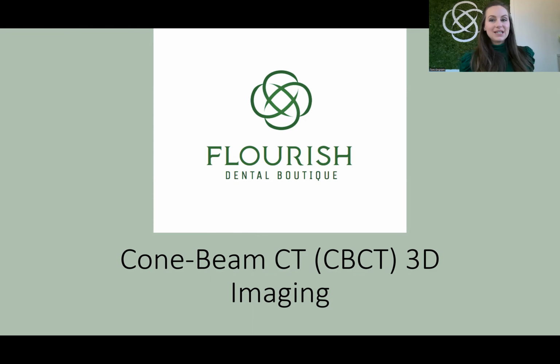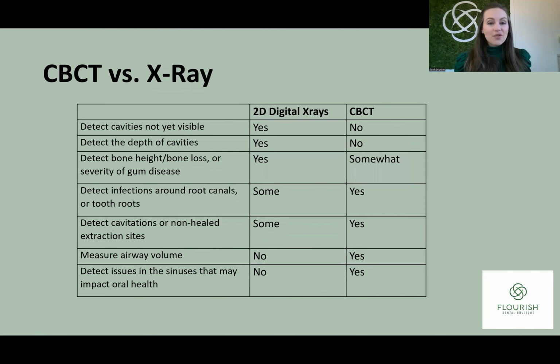So cone beam CT, or CBCT, is a type of three-dimensional X-ray that is becoming more and more common in dentistry. It provides vastly more diagnostic information than we've ever had before, tailored to viewing the details of the mouth and the head. It does not replace traditional X-rays, however. So here's a summary of the capabilities of both types of imaging.